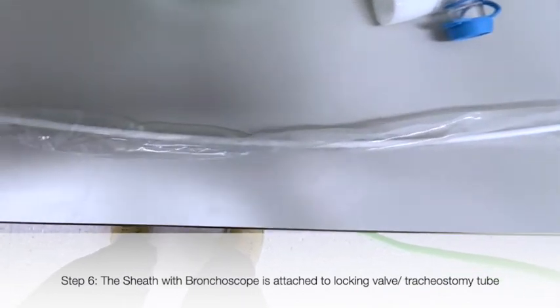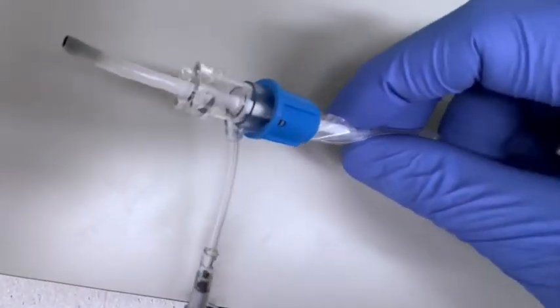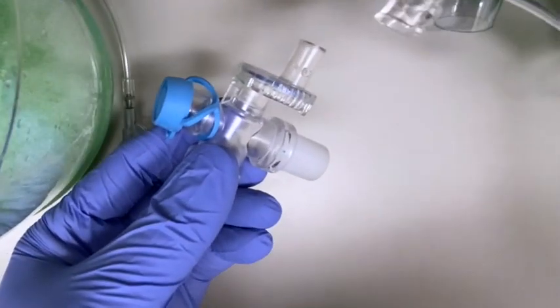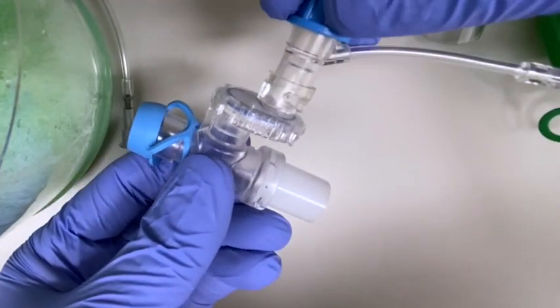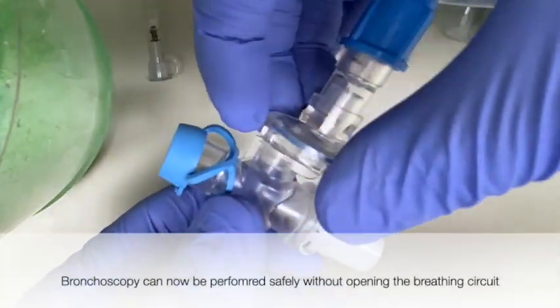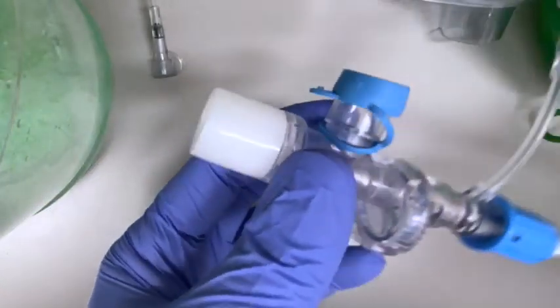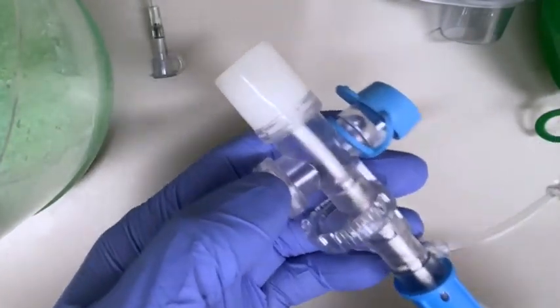Following tracheostomy, the sheath is attached to the bronchoscope. The same locking mechanism can be attached to the open and closed valve as shown here. In the closed position, the bronchoscope will not pass, but when it is turned into the open position, the bronchoscope can be passed through this valve, which would be attached to the tracheostomy tube.